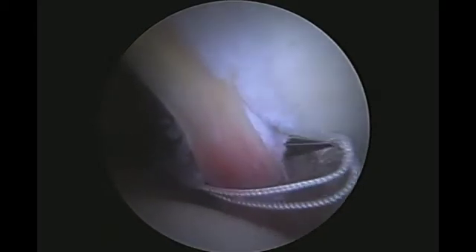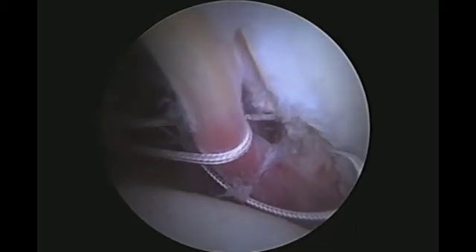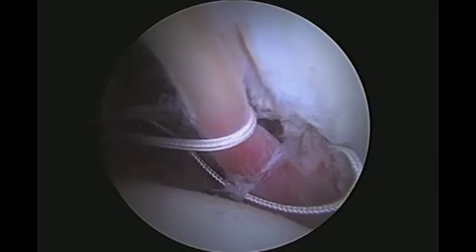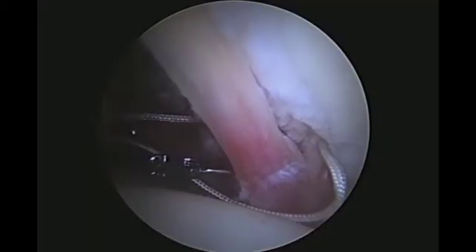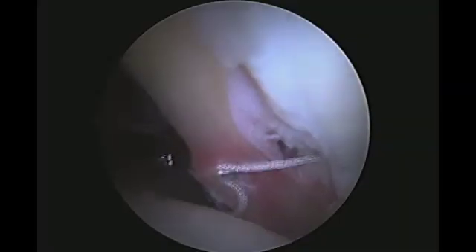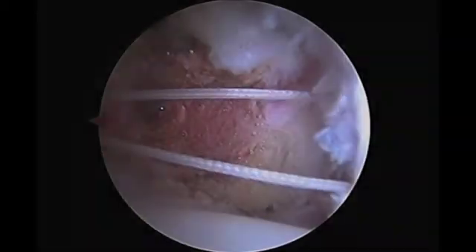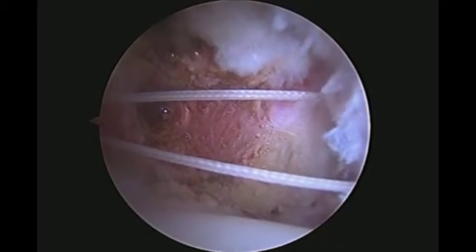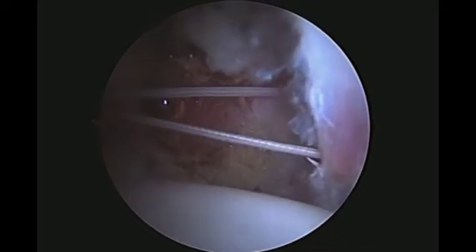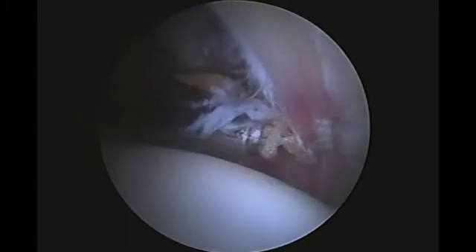One limb of suture is retrieved through the tear. The bird beak then penetrates the mid-substance of the labrum to create a vertical mattress configuration. A sliding Westin knot is used to secure the repair, reinforced with multiple half hitches, which are tightened circumferentially in front and in back of the knot.